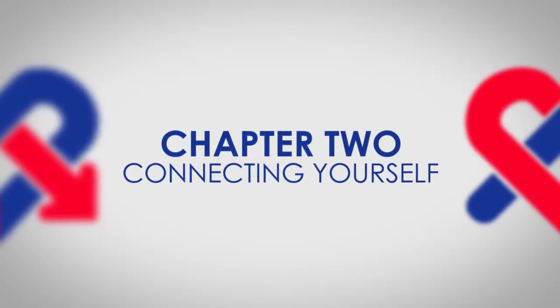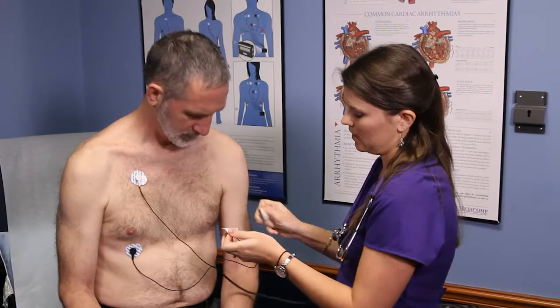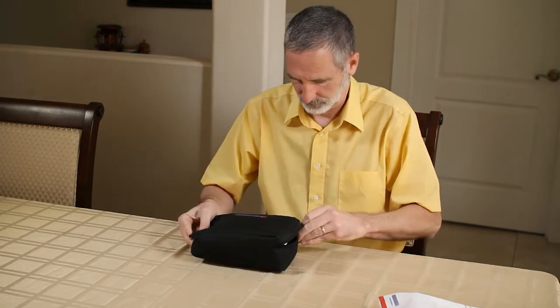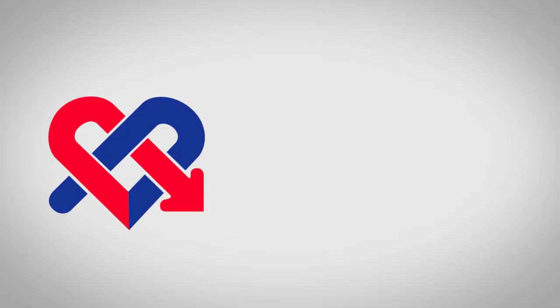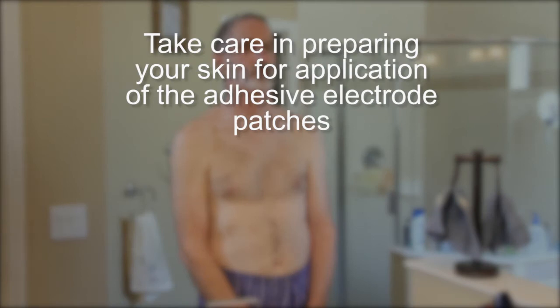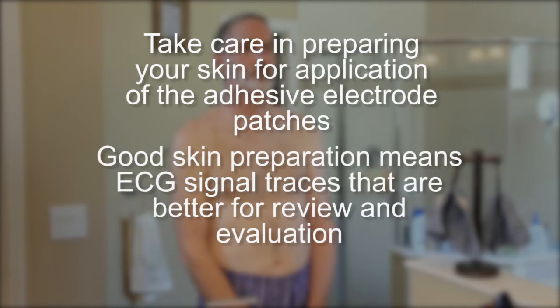Connecting yourself. The doctor's office may have connected you to the monitor, or you may have received the monitor in the mail to hook up yourself. Let's take a moment to review the process on how to connect yourself. Preparing your skin: before applying the electrode patches, follow the steps on how to prep your skin. Good skin preparation means ECG signal traces that are better for review and evaluation.